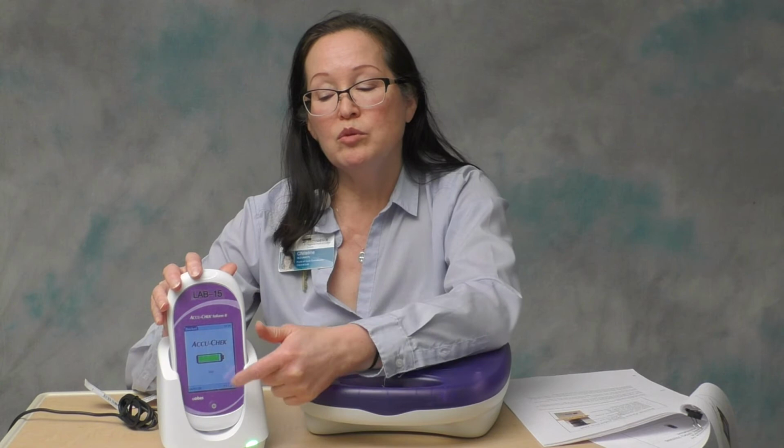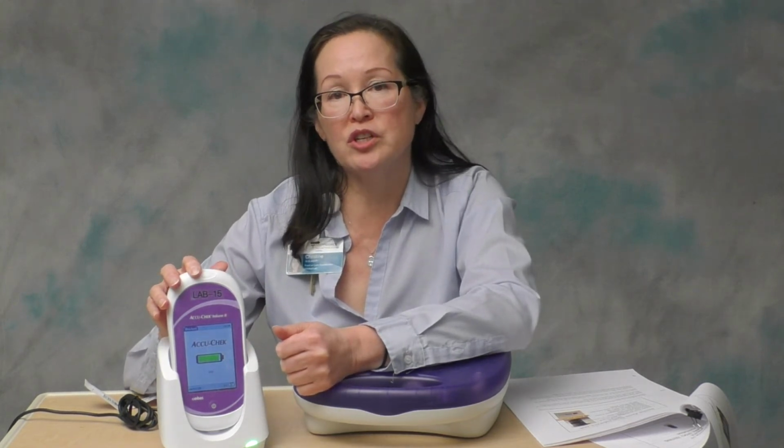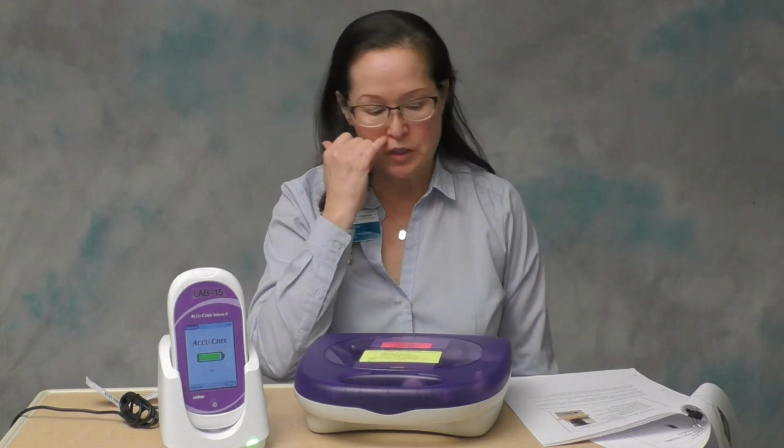It'll just be a big empty red battery icon that indicates the battery is completely dead. You need to dock it and make sure that you get the lightning bolt going through it. That indicates that it's charging. Again, 1 hour for a dead battery or partially dead battery to fully recharge.